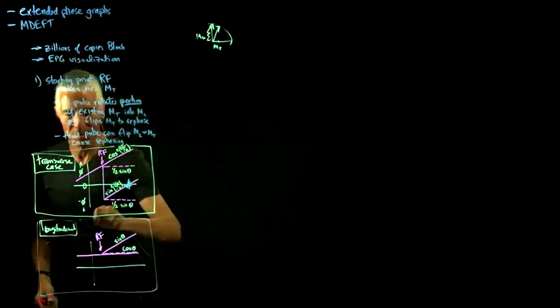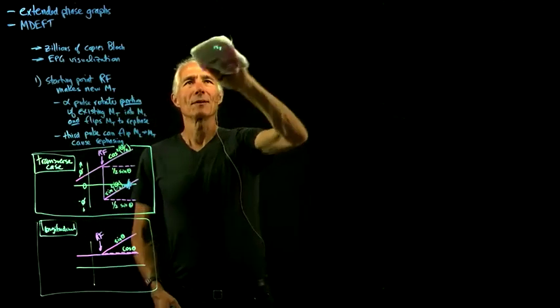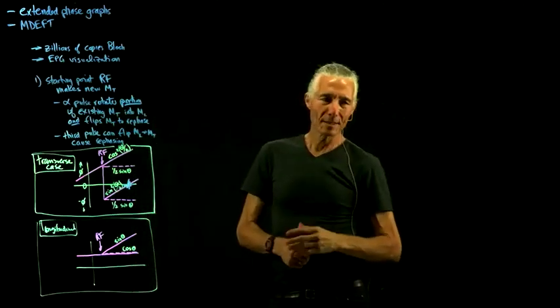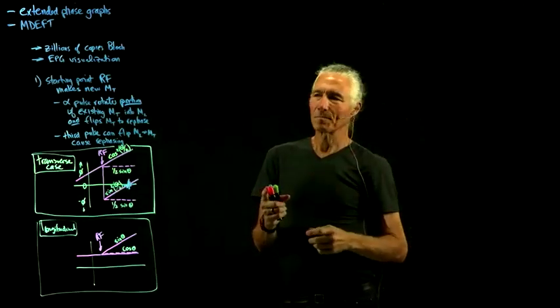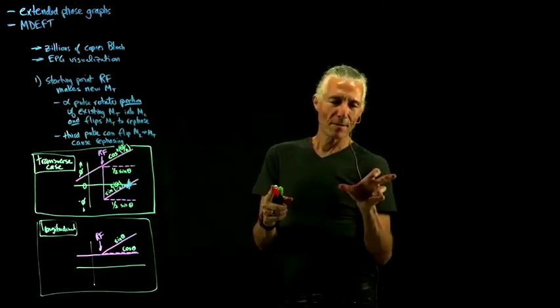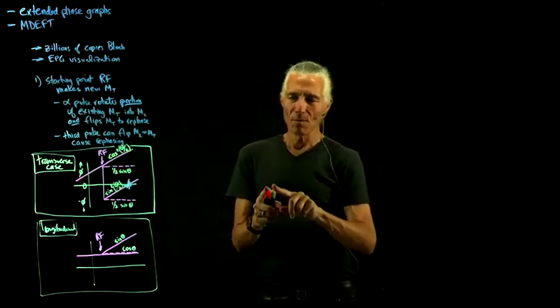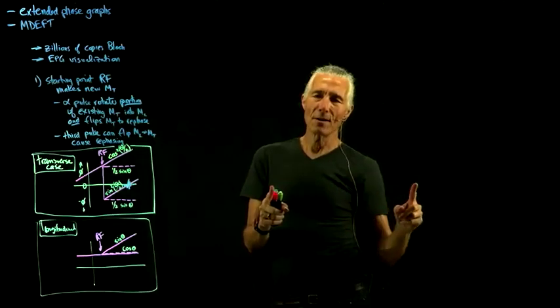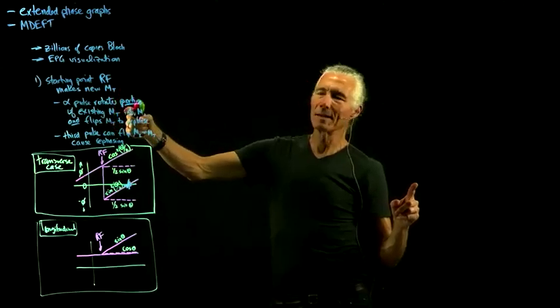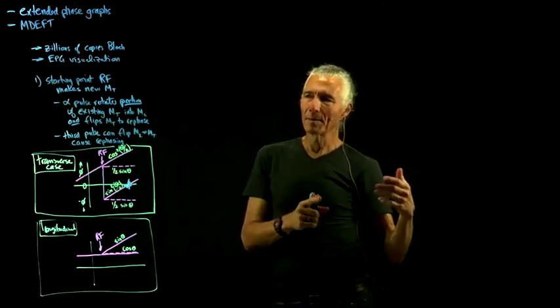And so now that we've got those rules, we can apply them to that 3 RF pulse case that we talked about. As the simplest case, if you do 1 RF and then another RF, the same amount of time after it, you get a spin echo. And if you don't do any more RF, nothing happens. But if you do 1 RF, a second RF, and then a third RF, then you can sort of save some of the magnetization and you can get a series of echoes. You'll get additional spin echoes after that, but you'll also get the stimulated echoes.